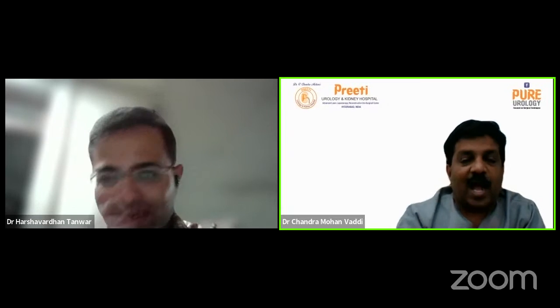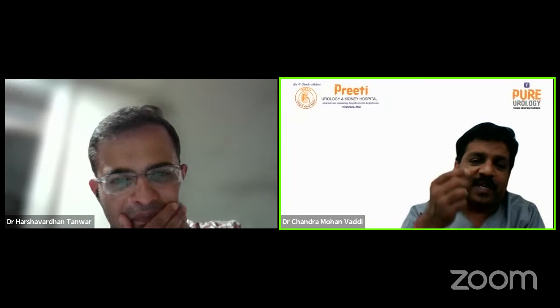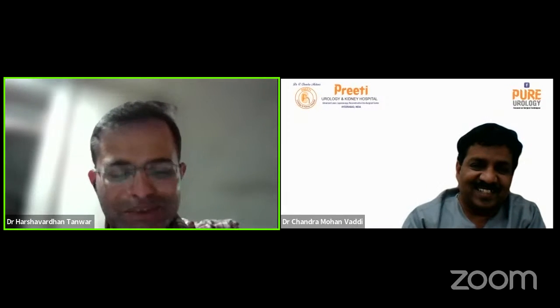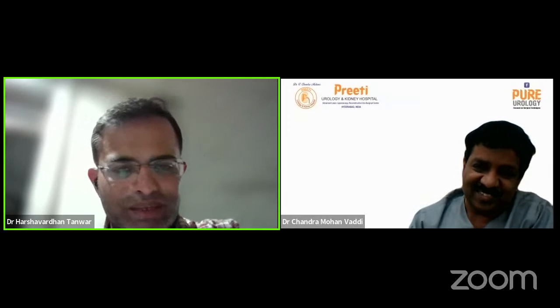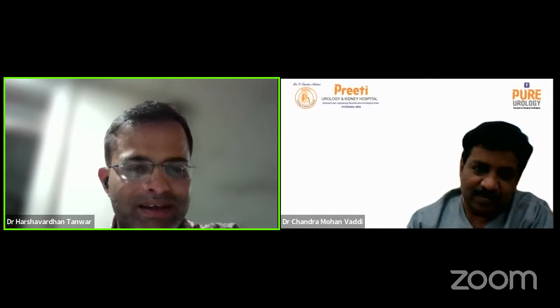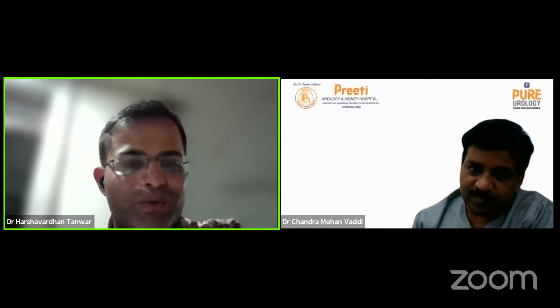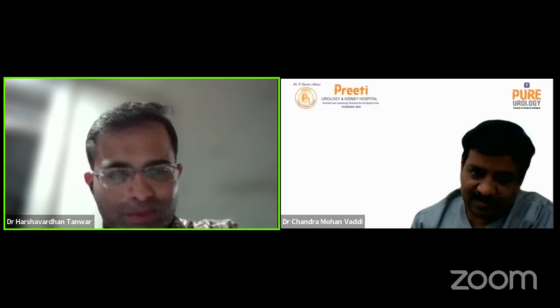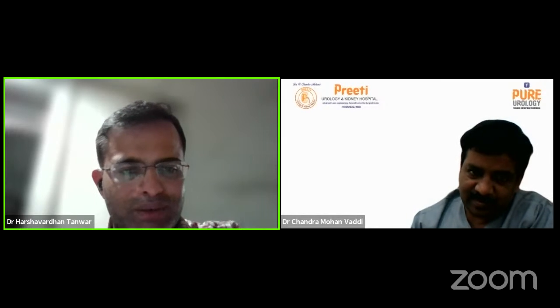Sir, as I have already told you, you are a close friend, that's why I'm taking a little liberty on this. Sir, nowadays I'm having a junior, Dr. Sanket, who is trying to learn the PCNL technique, and I'm happy. The last time I told you that it is not reproducible, but looking at Dr. Sanket, he is doing an excellent job right now.